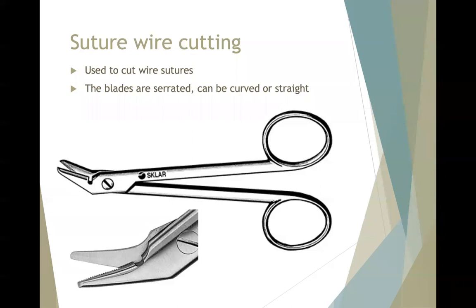It's pretty incredible. If you ever work in ER or in trauma, you will see this all the time. But the most common place we're going to be placing wires and removing them is in the jaw, or just up in the cranial region. Thinking about soft tissue, you're not wrong with the fact that we place staples in soft tissue. So we do place certain metal sutures in soft tissue, but when I'm talking about actual metal wire, that's wiring the jaw shut, most of the time working in oral and dentistry. So not wrong necessarily. I'm just talking more about a wire suture.